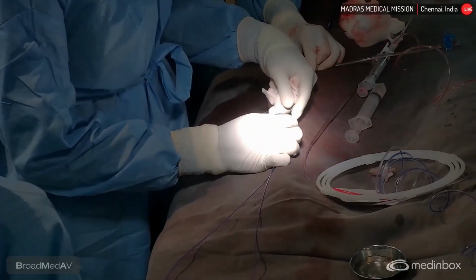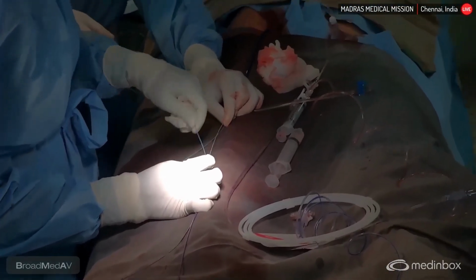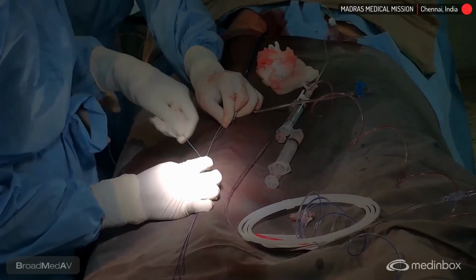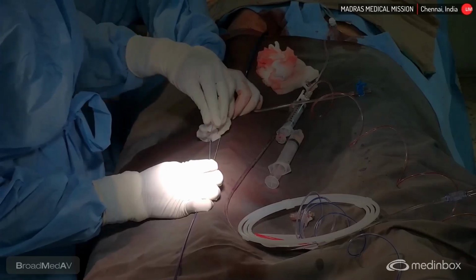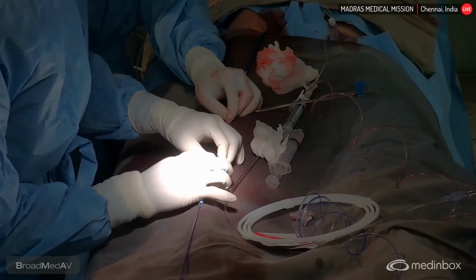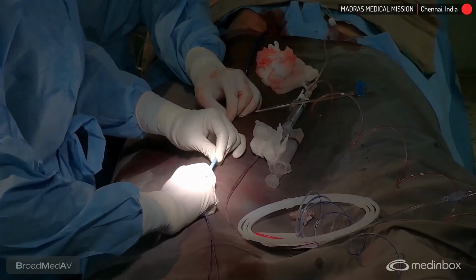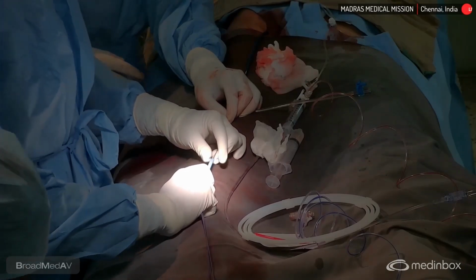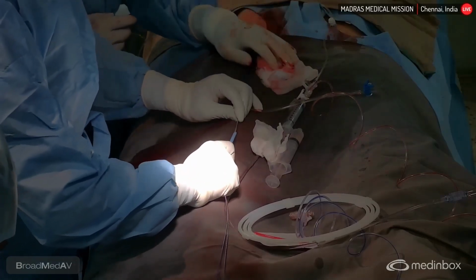Show the light here. Both are out. Again, I'm rechecking both. I'm covering both. Both wires alone, you hold it. Both are Admiral Xtreme 12x4.